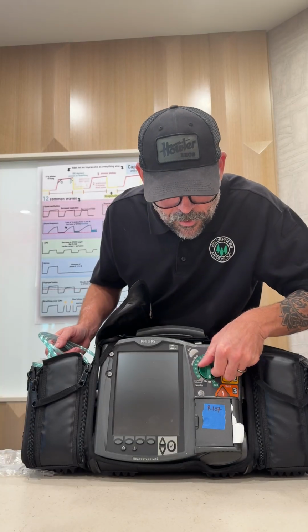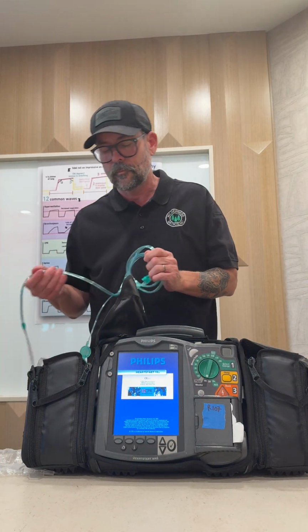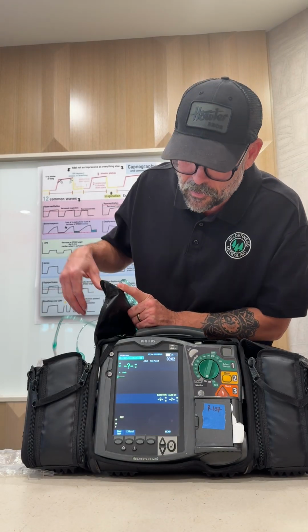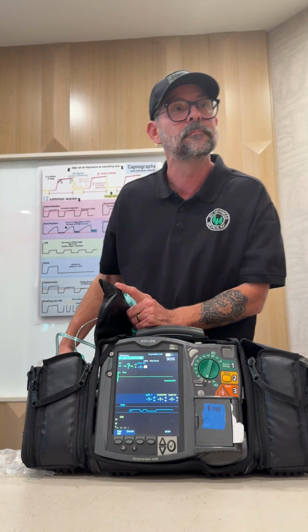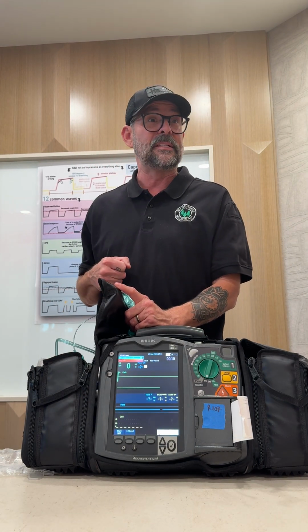once we turn on the monitor and it goes through its warm-up, we're going to see the capnography waveform here at the bottom. And we also know that the patient is apneic.